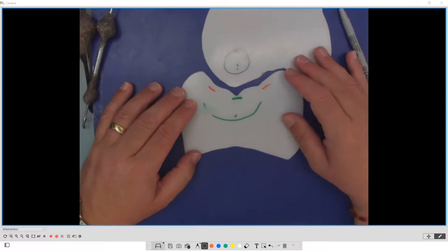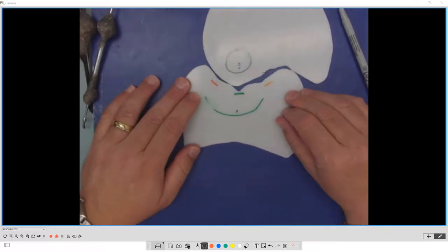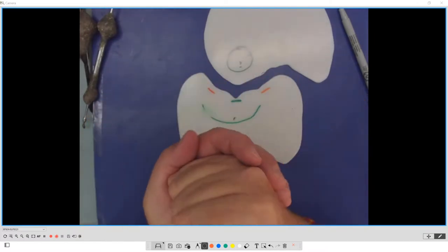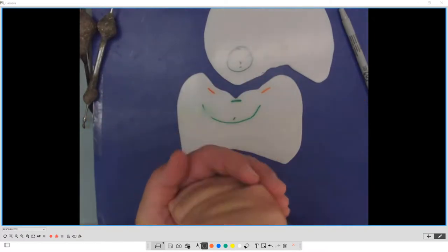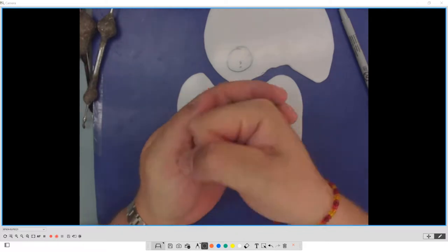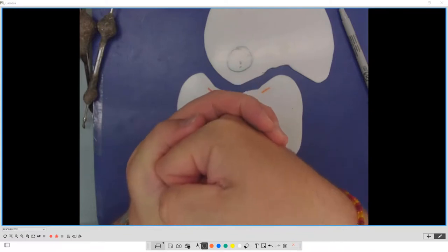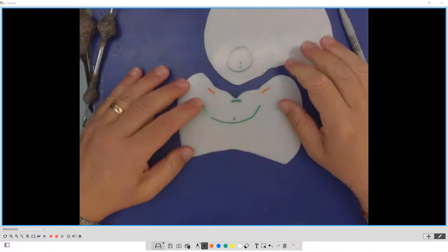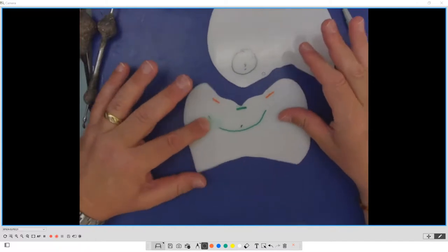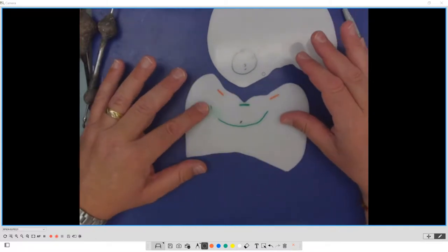What have I learned? Crush it. I want up and I want crush this way. I don't want to mill it. I want to crush it. Mortar and pestle. This is mortar and pestle, okay? Like the pharmacy or on the food channel, you're doing this. This is how you want things to work in the mouth. Get away from the motion of milling, because that causes the tip, that causes the stress, that causes the chipping.